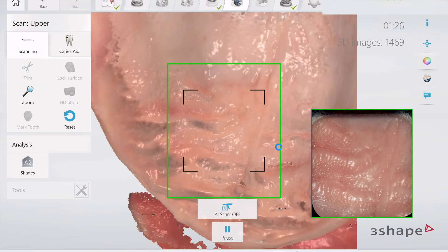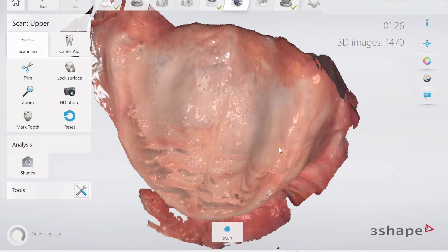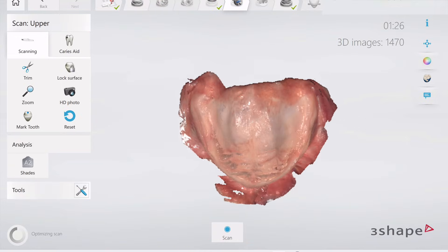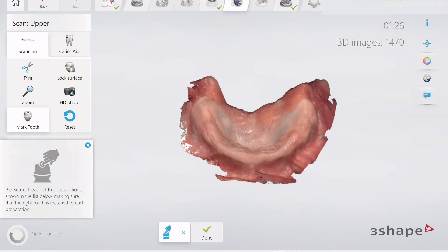Usually the maxillary scans are a little bit easier than the mandibular scans, but our mandibular retractors are unrivaled when it comes to being able to get scans. So let me show you that.